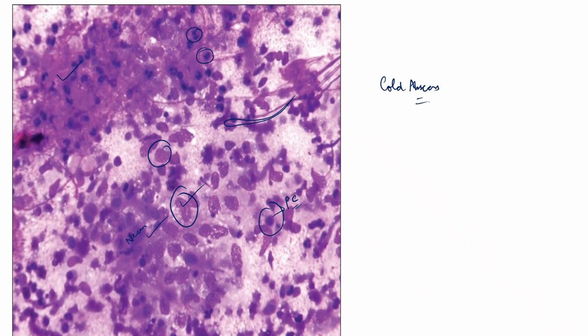So do not confuse cold abscess with infection. Please do not write suggestive of bacterial infection because you see neutrophils. Neutrophils are here along with the complete tuberculosis granulomatous inflammation picture. So you are actually dealing with a cold abscess. Mention your findings in your report and then write features suggestive of cold abscess. Tuberculosis should be excluded or confirmed by TB-PCR and CB-NAT. Whatever study you have done, just include your finding. If you have not done it, then just suggest.